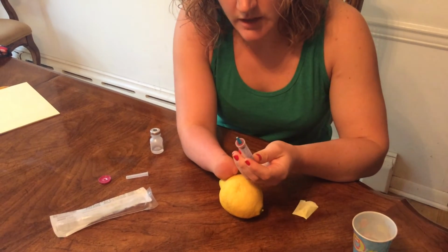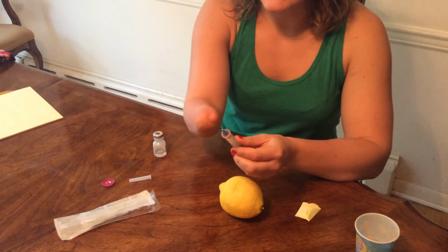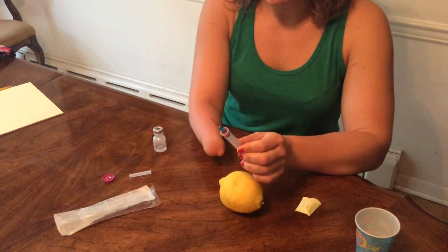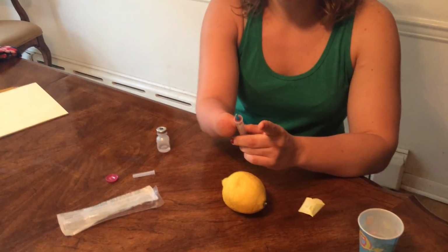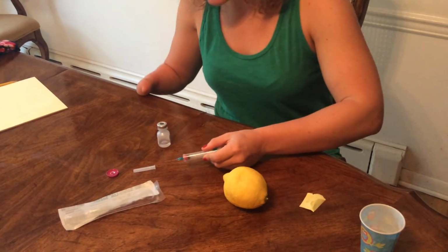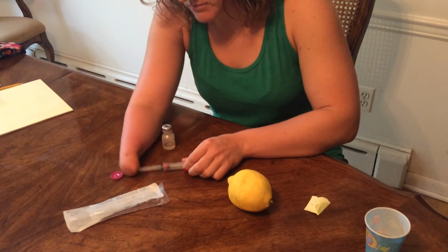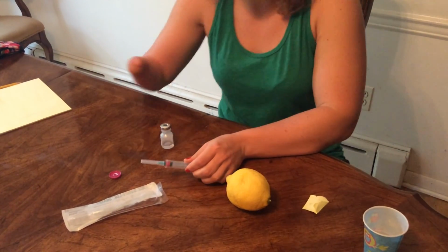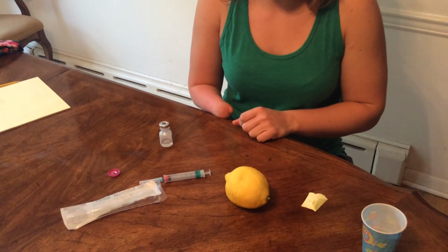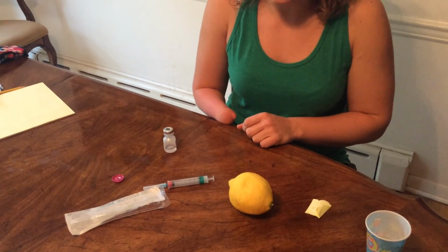Okay, and then if you have a safety, then you would activate the safety. Sometimes it's like a flip over thing, or it's like a little thing you click up. You would activate the safety at this point because you finished your injection. But we do not have it. So we're going to recap since I'm in my house, but otherwise you would just throw it right into the sharps container. And that is it. So that's how you do a one-handed draw up from a vial and an injection. The end.